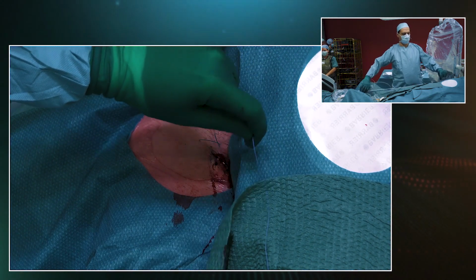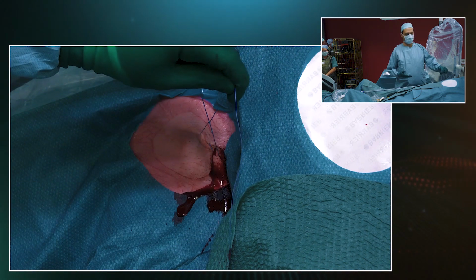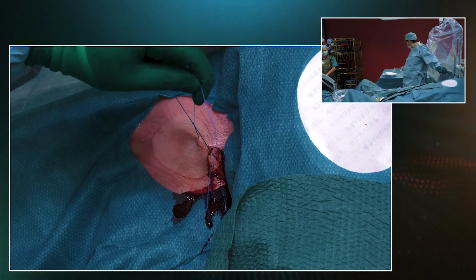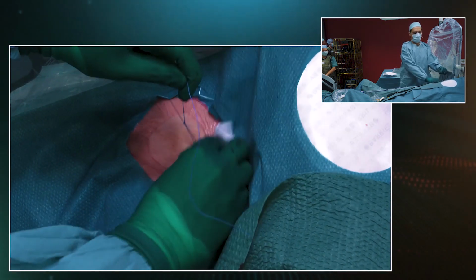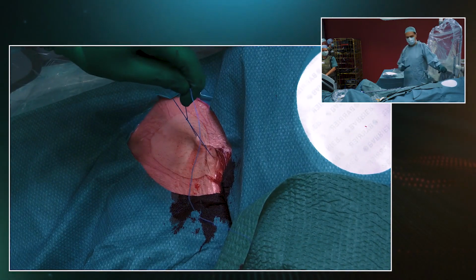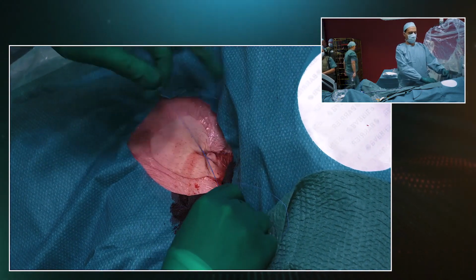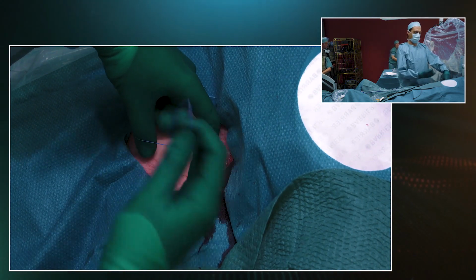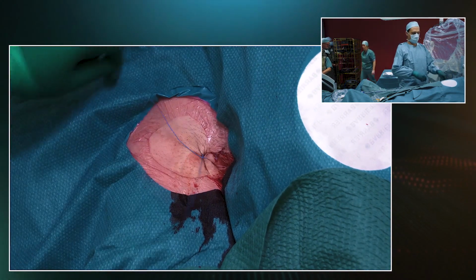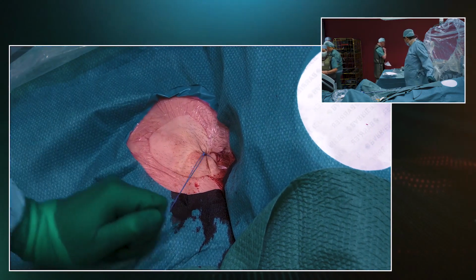you can see that if I let this bleed, of course, there's no hemostasis. If I simply pull on this structure, you can see that it's completely dry now. I'll put the blood away. You see it's not bleeding anymore, and this is because the skin is compressing the puncture site. So what I'm going to do is close this now, and we're going to leave this in place for 4 hours, and then the patient can start moving around. Very simple.